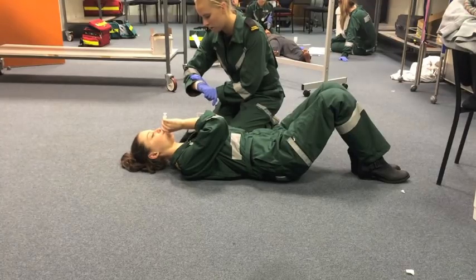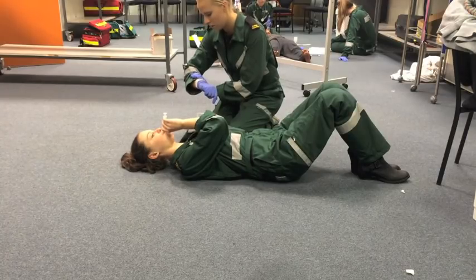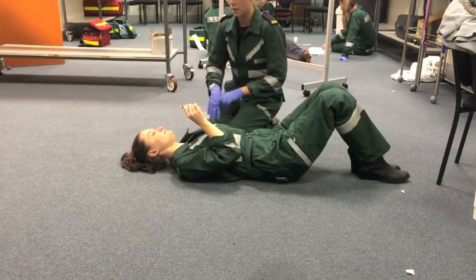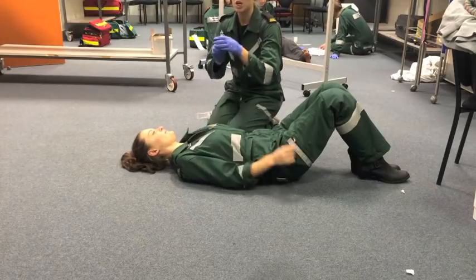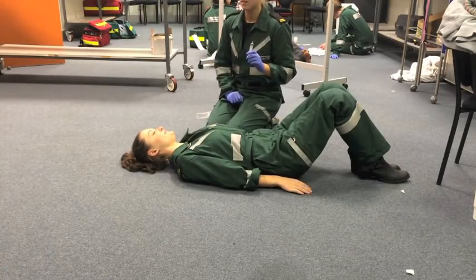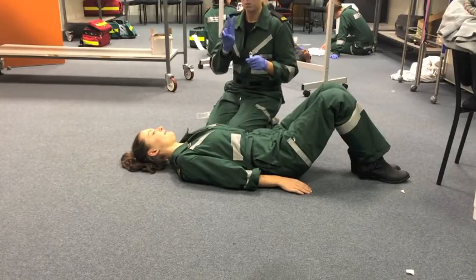After 15 seconds, the patient can breathe normally again. Inspect the monitor for any changes in the patient's ECG rhythm. If no change, retake the patient's blood pressure and perform the procedure after 2 minutes if still over 100 systolic. A maximum of 3 attempts can be performed.